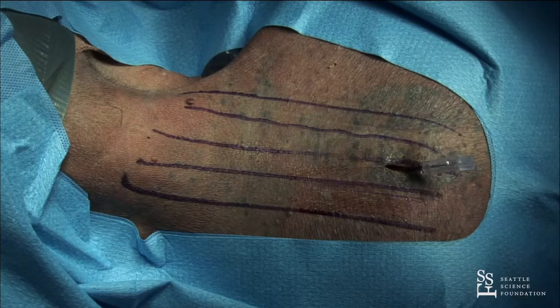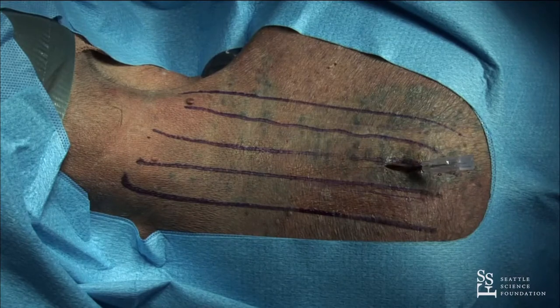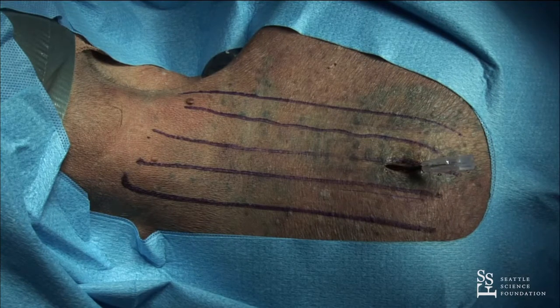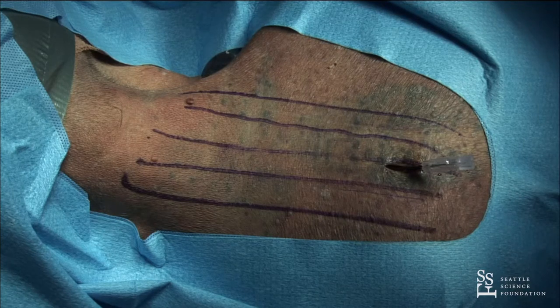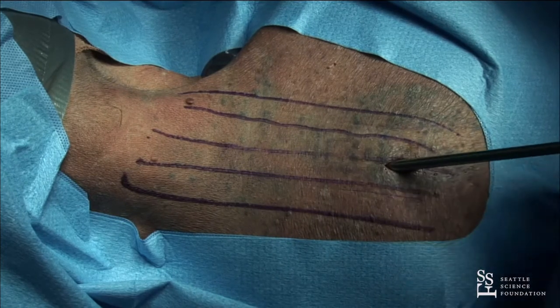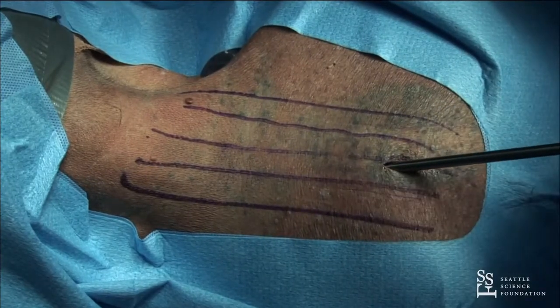So you're just making an incision just lateral of the mid-sagittal line, correct? Yeah — between the spinous process and the medial facet border. The reason for that: it gives you a slightly medial-to-lateral trajectory, so you're always aiming away from the canal. Make sense? Yes, thanks. So then the instrument is inserted through the incision, and you always advance on an AP.